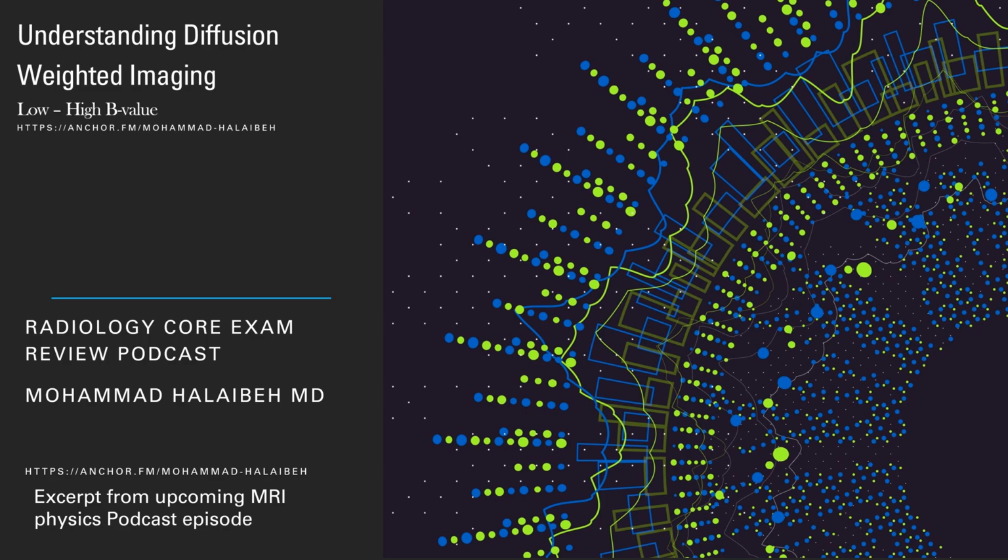When fluid motion is random, the signal from that part of protons is cancelled because it's random and it's not going in one direction. When do we have random signal? We have that random signal, for example, in an abscess, where it's filled with fluid, and that fluid is not going anywhere far, rather it's moving in the same place. The signal from those protons cancel each other, and on the ADC map we'll get dark signal.